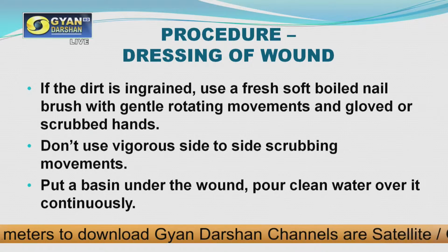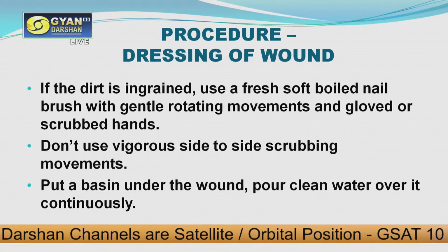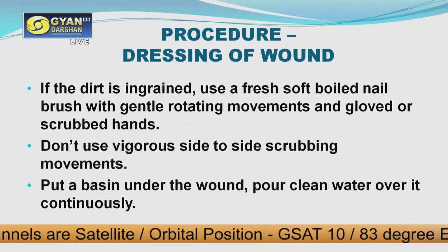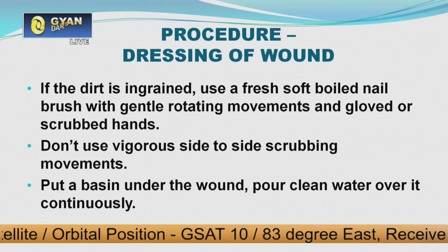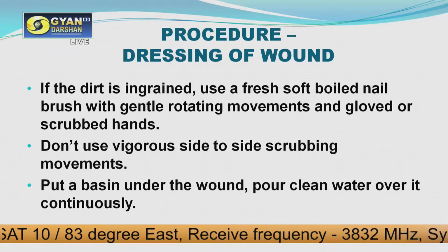If you are going deep in cleansing the wound, you have to use the boiled brush in a rotating movement, and either scrubbed or gloved hands.